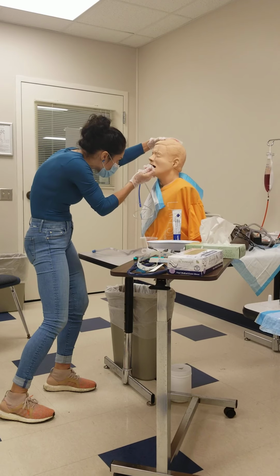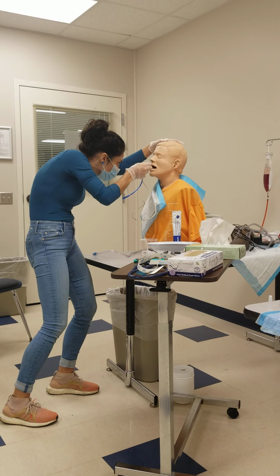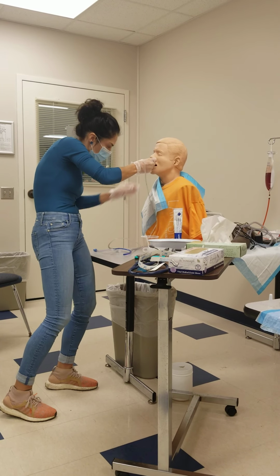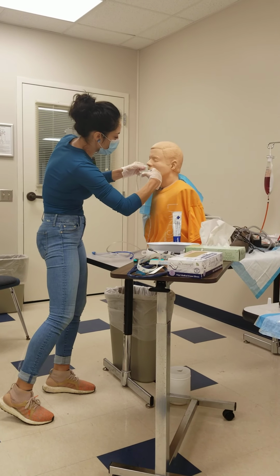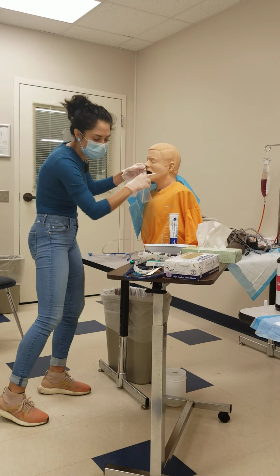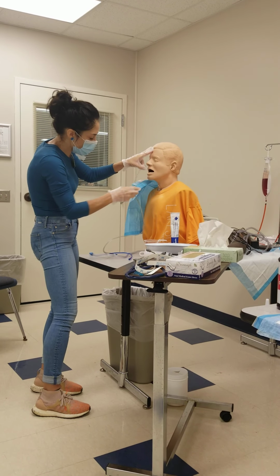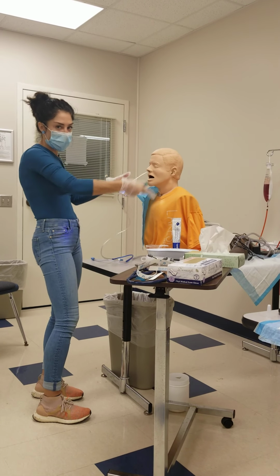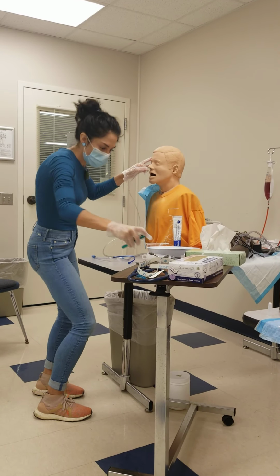Okay, so first I'm going to have him tilt his head back. And then once it gets essentially to the back of his throat, okay, sir, now I need you to tilt your head forward for me. Okay, and as he's drinking the water, taking sips, I'm feeding this down. If it were met with resistance, I could have him tilt his head back, and then I would look to see if the tube was coiled up. If it was coiled up, I would remove it and start over in the other side. But it is not, it is going straight down.